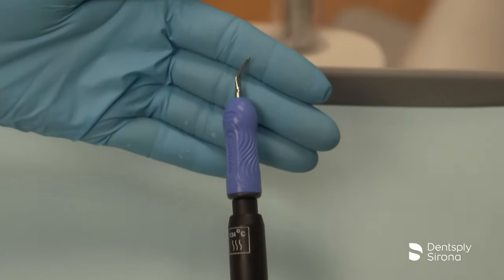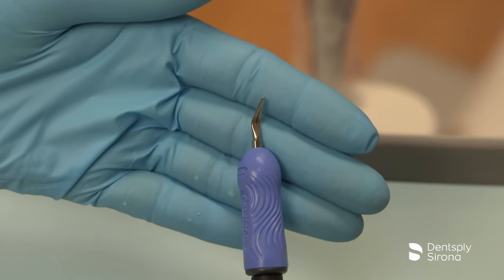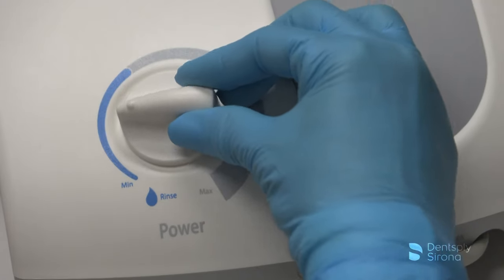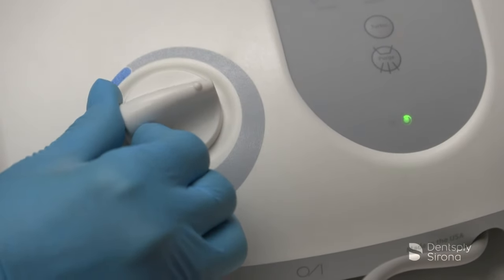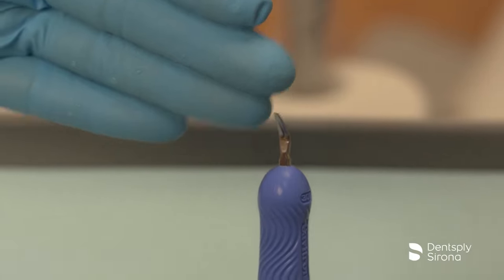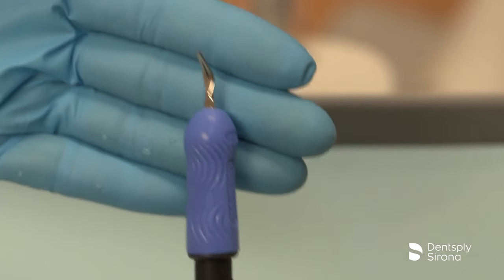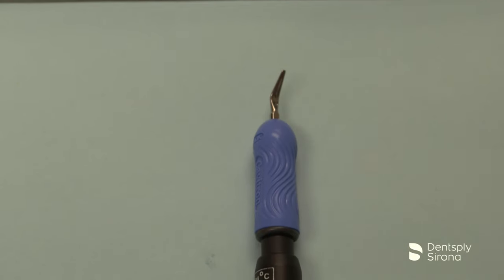This is the Cavitron FSI-3 beaver tail. It is designed for removal of calculus bridges and removal of heavy stain, and can be utilized at all power levels. The Cavitron FSI-3 beaver tail has a rounded toe design which enables clinicians to adapt the toe for removal of heavy deposits in larger pieces and sections.